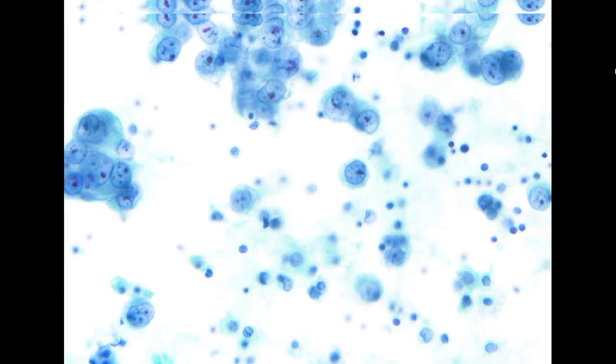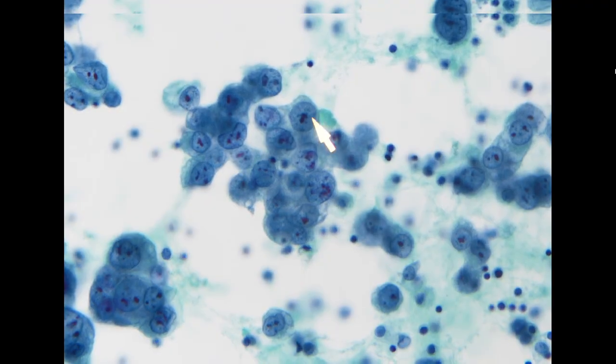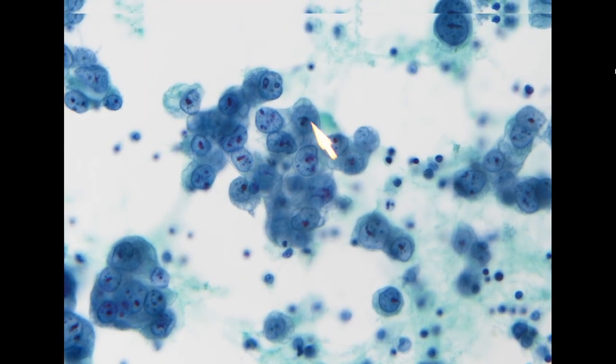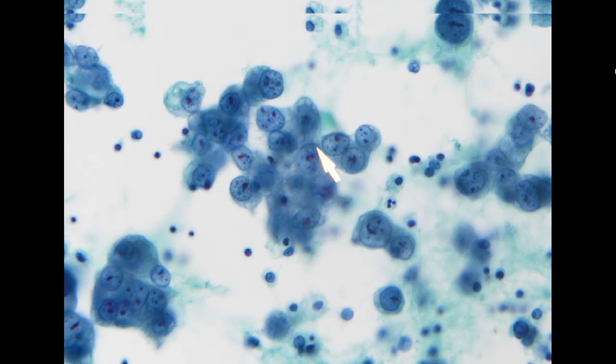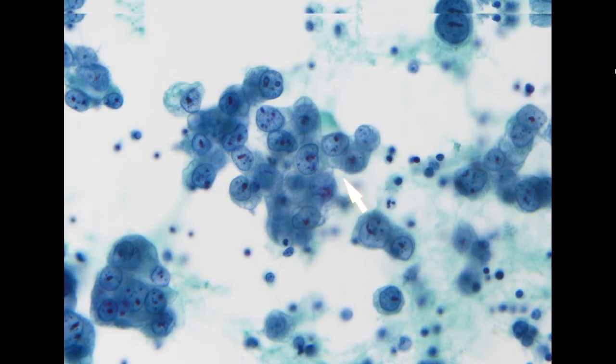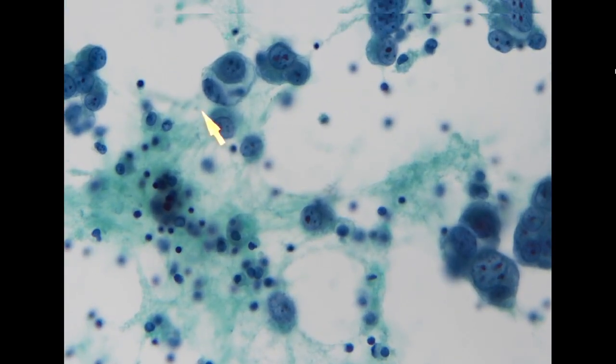So these cells have very typical cytomorphologic features of adenocarcinoma. We see increased size of the nucleus. The chromatin pattern is vesicular. The nucleoli are prominent. The size and shape seem to be pleomorphic, and it is arranged in a very tight three-dimensional glandular architecture. In the cytoplasm, we do see some vacuolation, and the nucleus is often eccentric. So these are typical cytomorphologic features of adenocarcinoma.